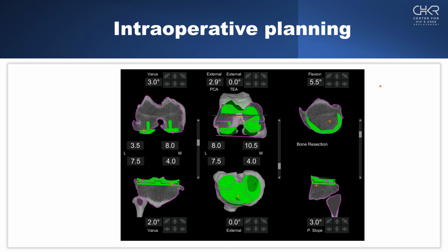We know whenever we're balancing a knee, there are three ways that we can do it to plan our cuts. One is the robotic way of using an 18-18 heuristic on the box. Another is measured resection, and another is gap balancing. Because we're so tight, we're not going to be able to use the 18-18 because we just can't get that measurement. So we're going to do this in a two-stage plan. Stage one will be using a measured resection technique, and then we'll use gap balancing for our fine-tuning, with our trials and with our lamina spreader once the cuts have been made.